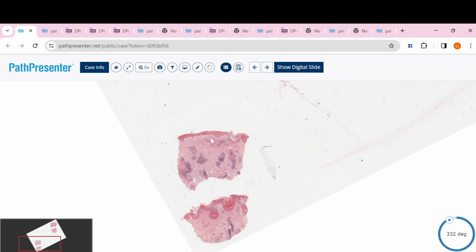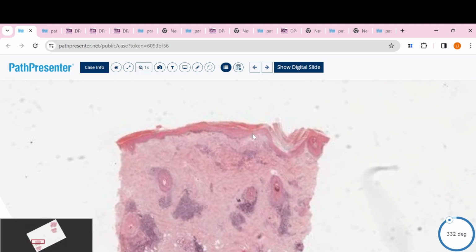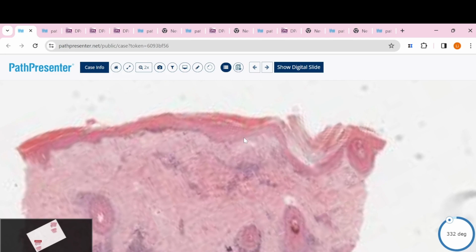And then when you try to make the definitive diagnosis for lupus, you always need to go to high power, because there are other features you also would like to see. But lupus is really tricky. But I think for this one, it should be easy. The internet may be slow.